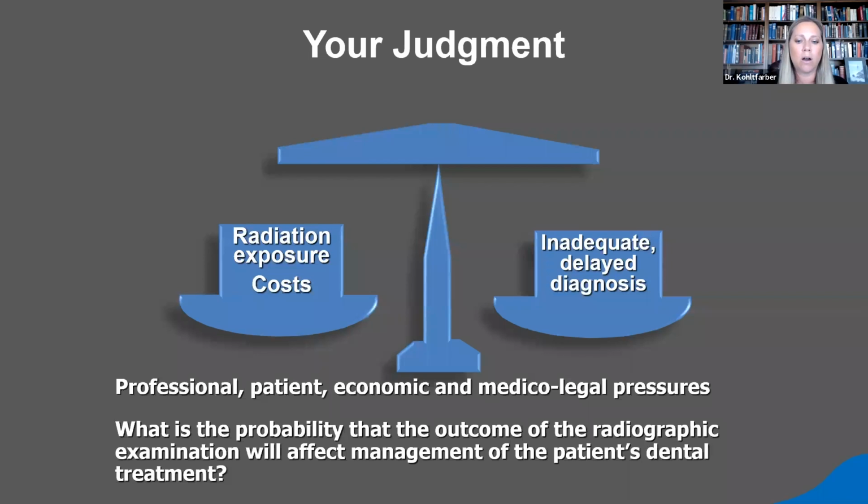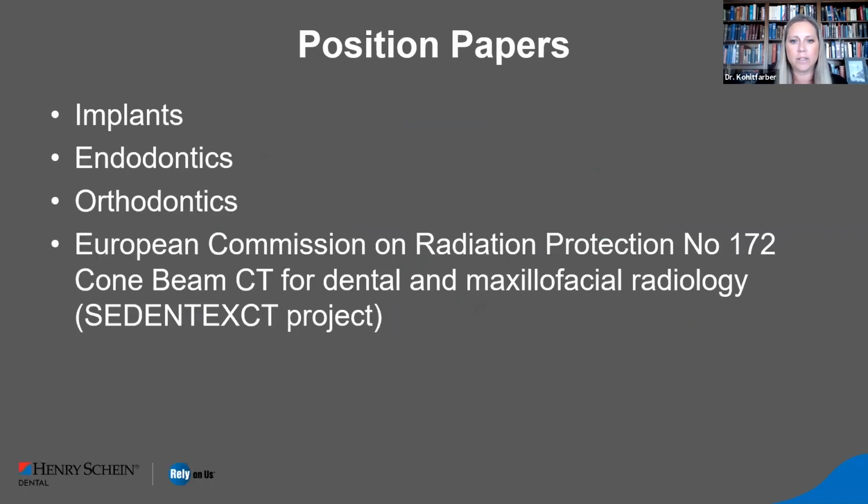We know that there are professional pressures, there's patient pressures, there's economic pressures, the medical legal pressures. What does it all boil down to? Will this CBCT affect the management of your patient's case? Is it going to affect the dental treatment that you're going to provide? And if it is going to be positive, if it is going to help you be able to better visualize, then that benefit outweighs the risk. So we're always looking at that risk-benefit analysis. There are various position papers.